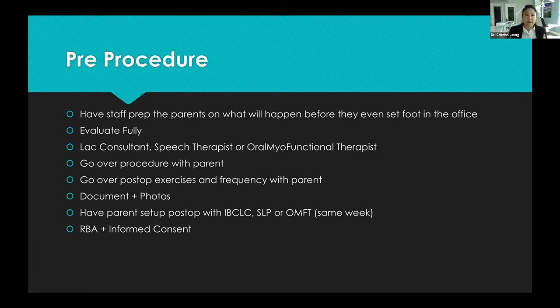I do let them know that I haven't found any around here who really do it with laser. A lot of them will do it the way that they were trained, which is more traditional and still works, with a scalpel or scissors and sutures. On tiny babies, sometimes that requires general anesthesia. I just let them know that that might be a thing, but call them and see what their typical procedure is, and decide if that's what's best for you. A lot of times they're like, nope, laser all the way. But it's always great to let them know that that's an option.